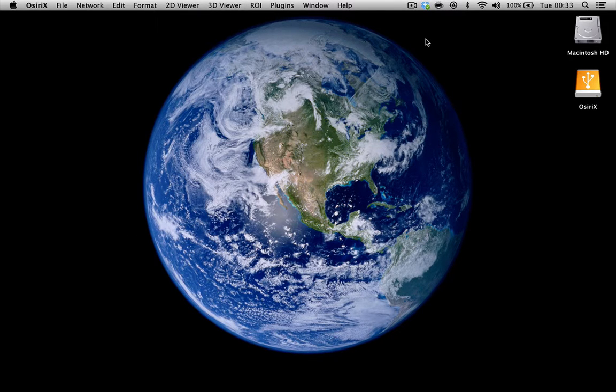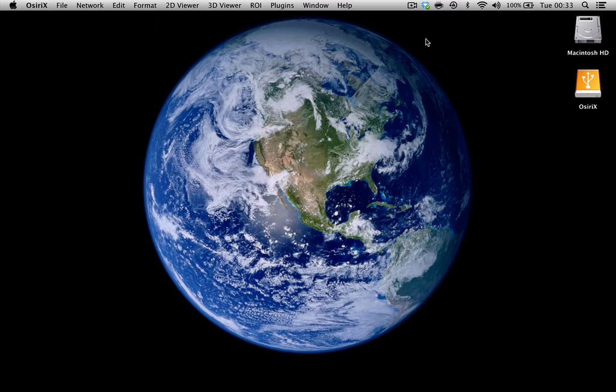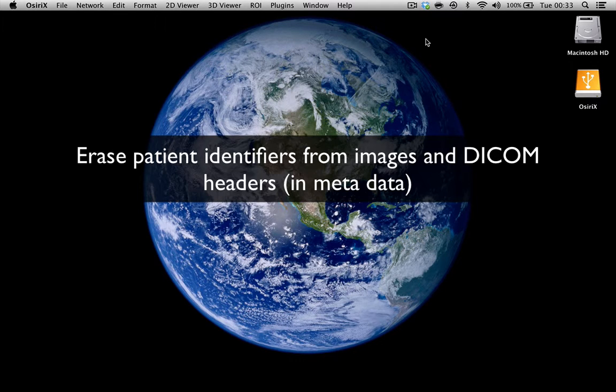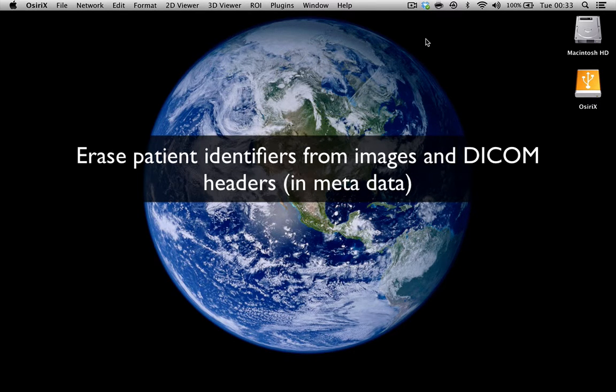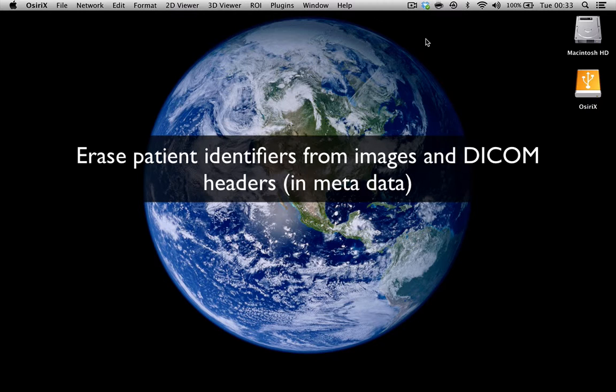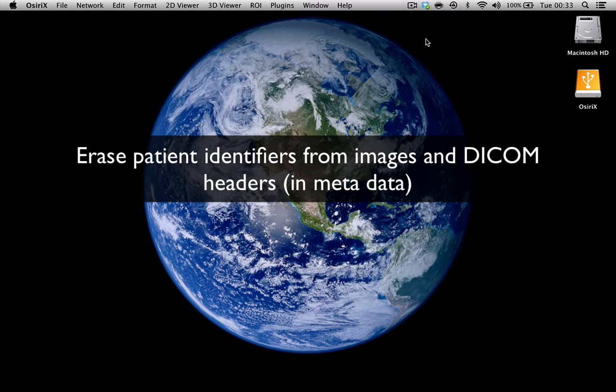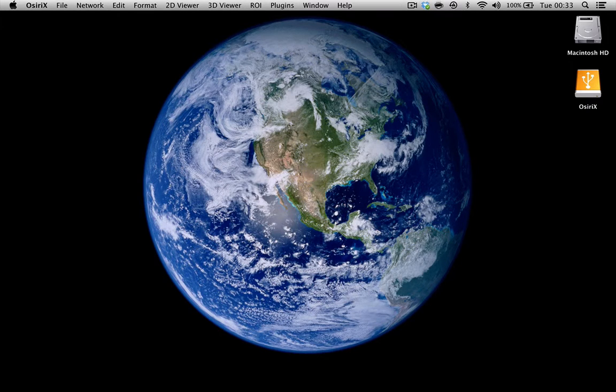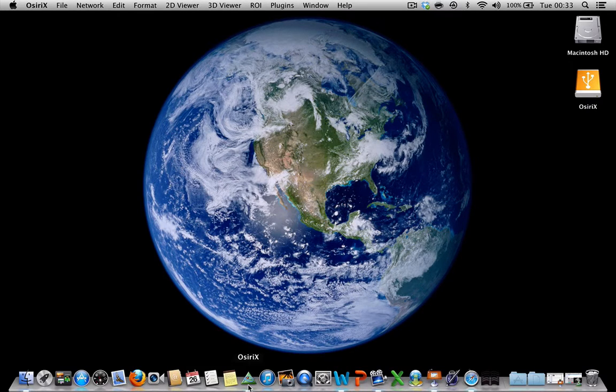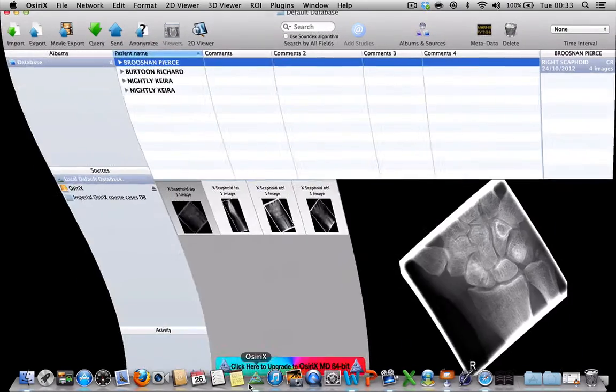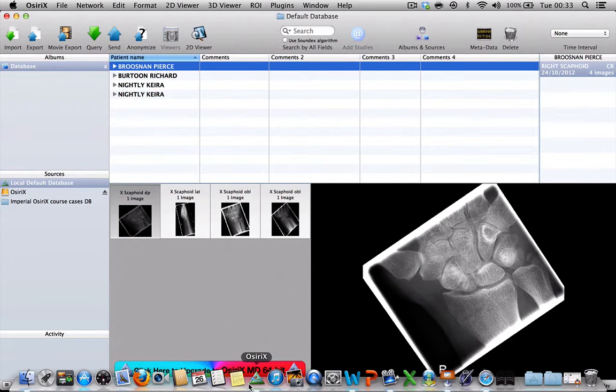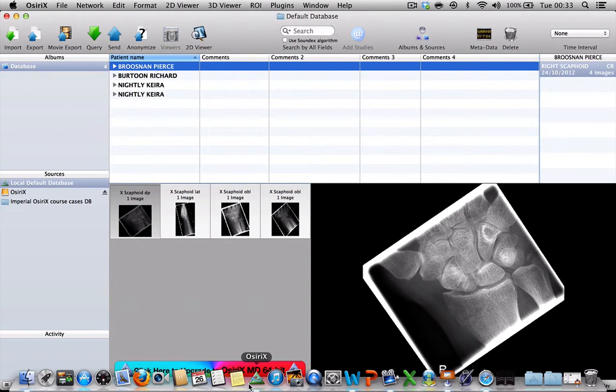Now it's clearly very important that when you import cases for teaching that there are no patient identifiers either on the image itself or more importantly on the DICOM headers that are associated with the patient. I'm just going to open up my OsiriX database to show you what I'm talking about.